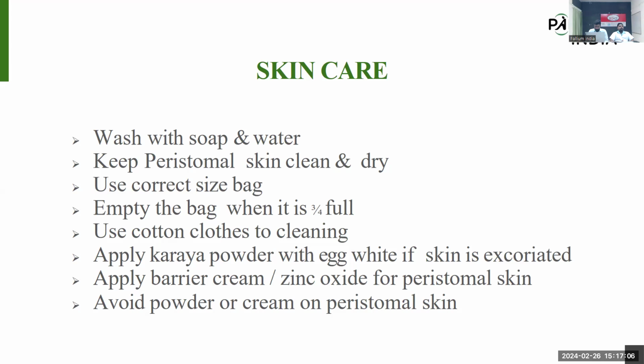Then we need to ensure the patient avoids using powder, any cream or any deodorants on the area, whether for avoiding smell, skin care or moisturizing, because it will disturb the peristomal region and the stomal region. So we need to educate the patient about that.